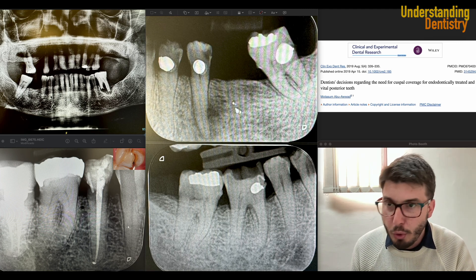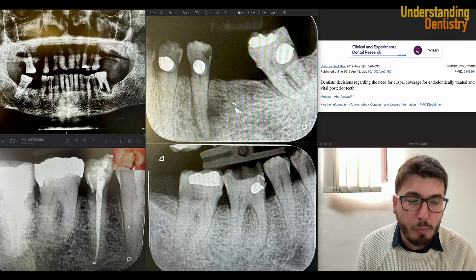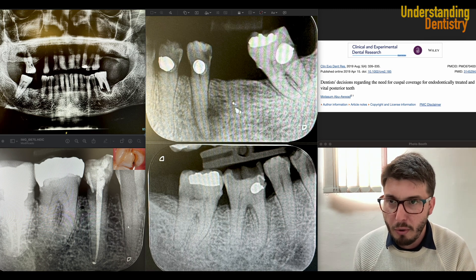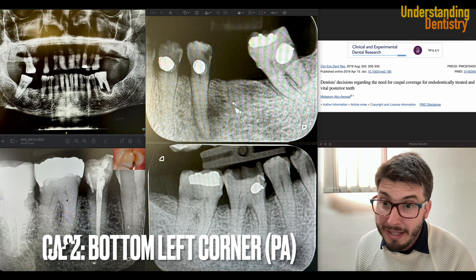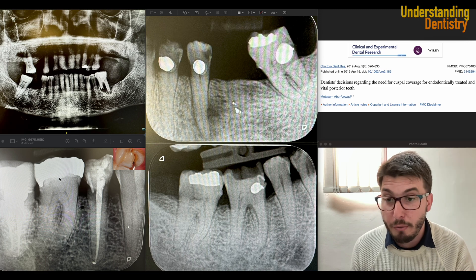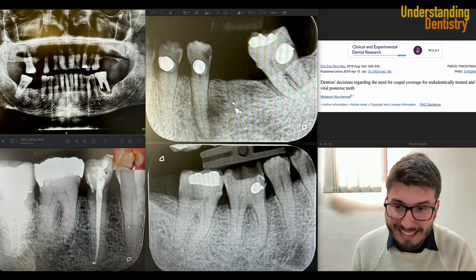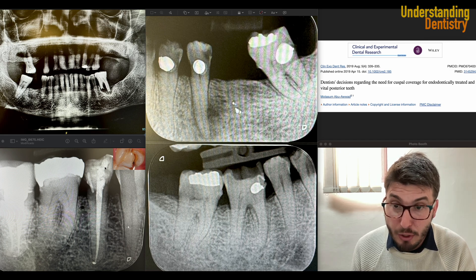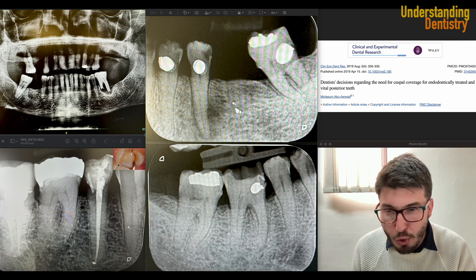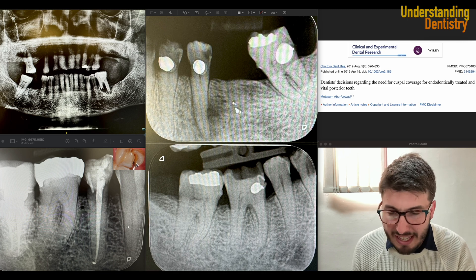Those would be the main decisions related to this case, and of course periodontal treatment will be done already because there is horizontal bone loss all over the place. Now commenting on the case in the lower left corner of your screen — the patient had pain on this second premolar and there was a fracture of the crown. This image illustrates the situation found for this case.